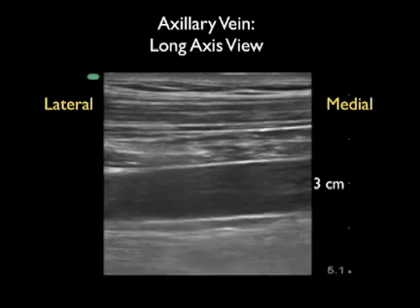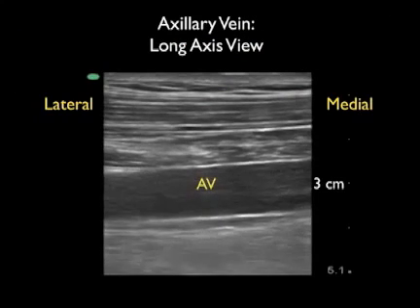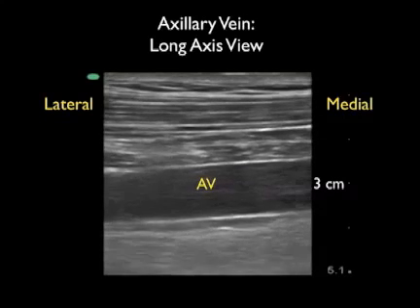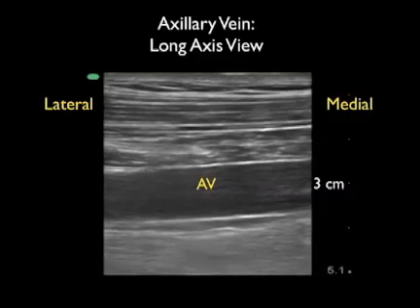Here's a long axis ultrasound image of the axillary vein as it courses from lateral to the left of the image to medial to the right of the image. Notice that the axillary vein appears as a tubular structure at about the 3 centimeter mark.